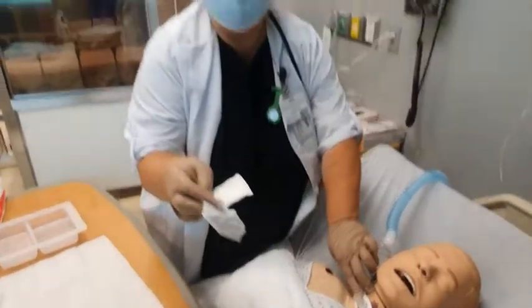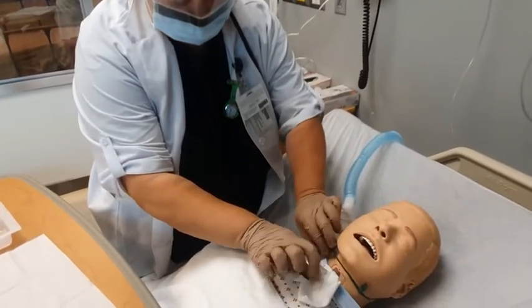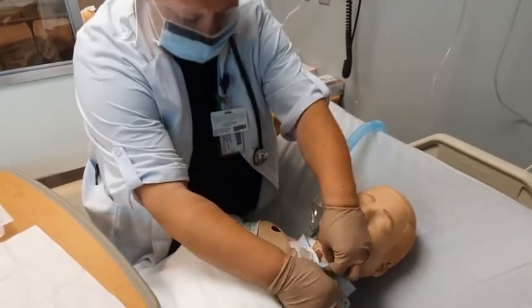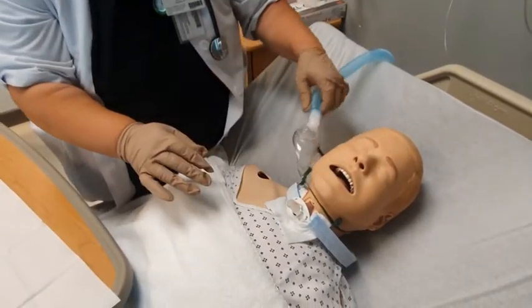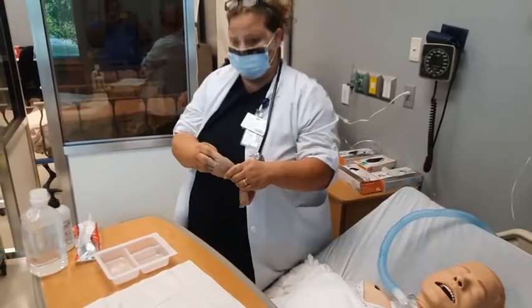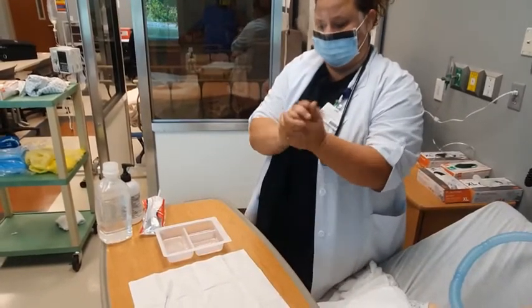So right now, you're not considered sterile anymore, okay? Because you will take this split gauze, and on the patient's chest, you will put this one side under one tie, and on the other side, you'll put it under the other tie. And then you'll remove your gloves and clean your hands. Make sure that you put the oxygen apparatus back on the patient. Remove my gloves. Cleanse my hands. And put on new non-sterile gloves.